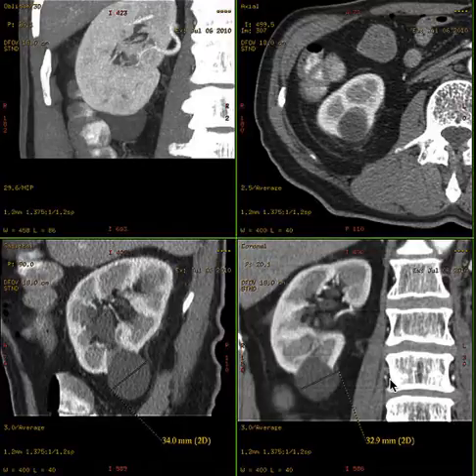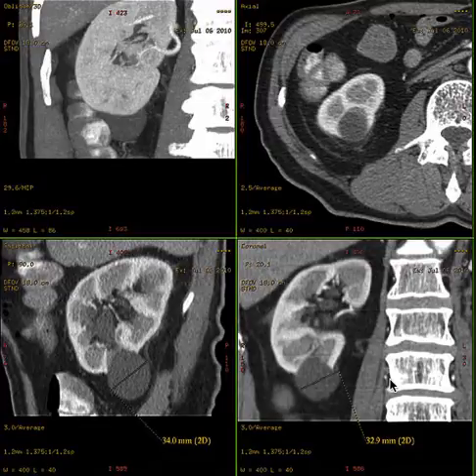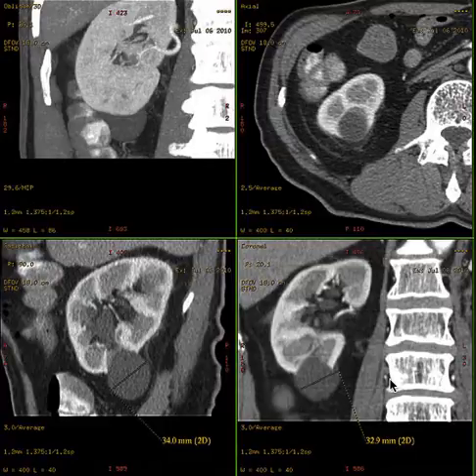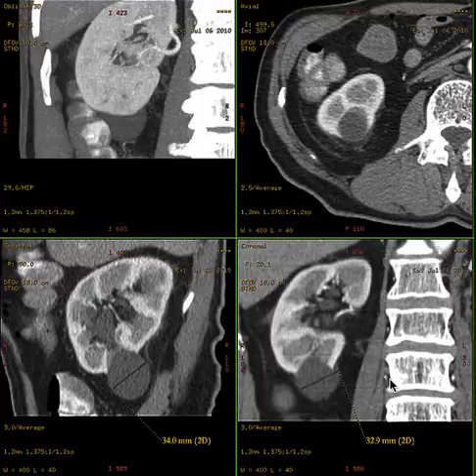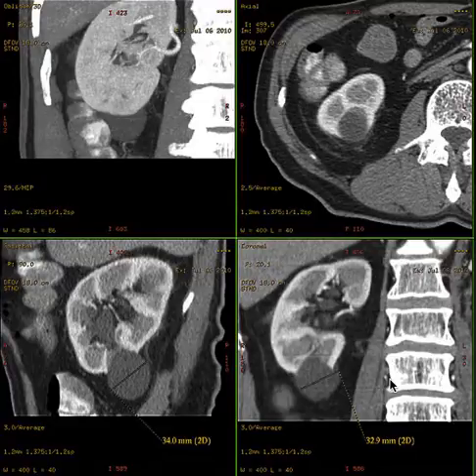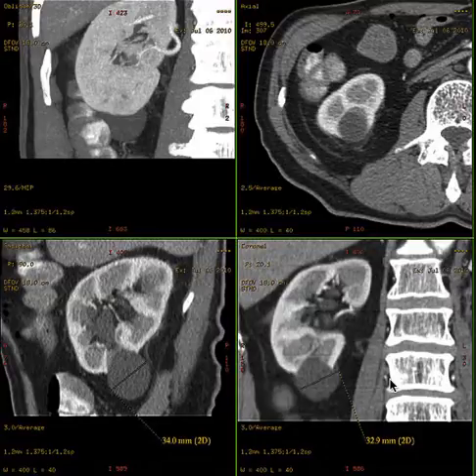Another thing that we tend to describe is whether this appears as a ball that's growing from the kidney and distorting the renal parenchyma, versus the bean shape, which is the normal reniform configuration of the renal parenchyma. That being said, we move on to what we call renal cell carcinoma, and it's important to know that as far as ultrasound goes, the renal cell carcinoma can really have any appearance. So although we might be more or less suspicious depending on what we see on the renal parenchyma, we cannot really exclude a renal cell carcinoma based on the appearance in ultrasound.